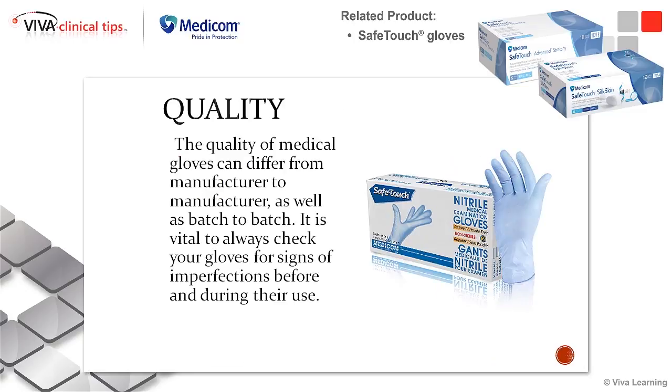But we have to look at what we're getting. Are we buying something that is of good quality? The quality of medical gloves can differ from manufacturer to manufacturer, as well as batch to batch. So be sure to check on them. And if you have a problem with them, remember this is also an approved medical device. So go back to the manufacturer. Let them know that you're having a problem.